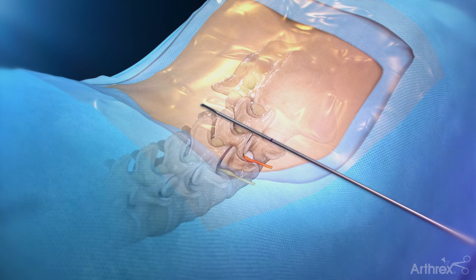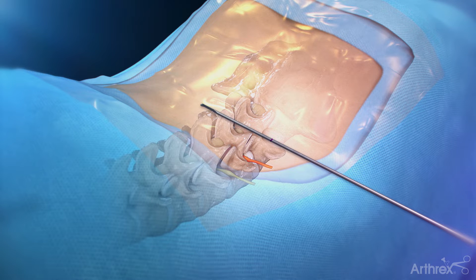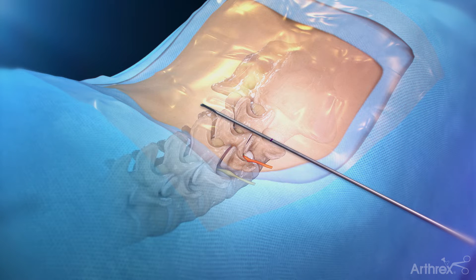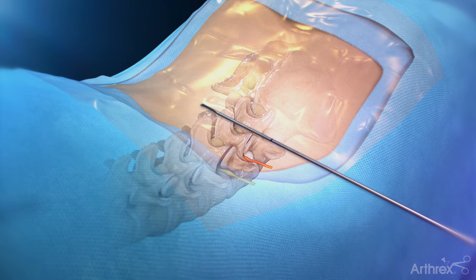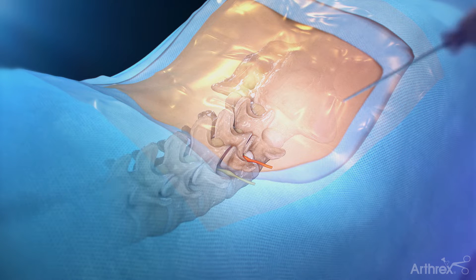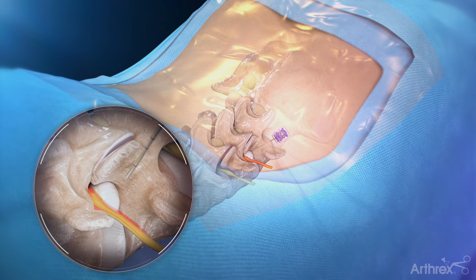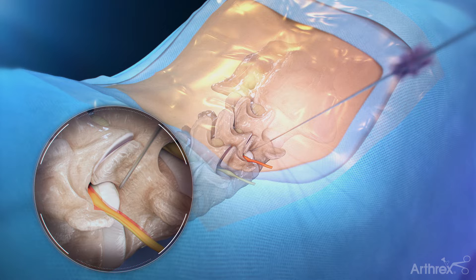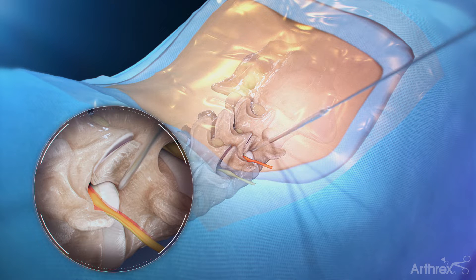An endoscopic approach can be employed to address this issue and is regarded as a highly effective procedure that may bring relief and restore mobility. To reach the affected disc during a transforaminal endoscopic discectomy procedure, the surgeon will use fluoroscopy or x-ray imaging to pinpoint the appropriate trajectory to place a needle.